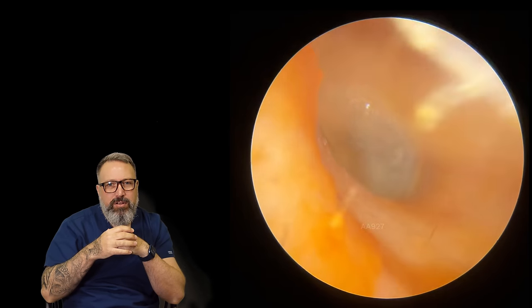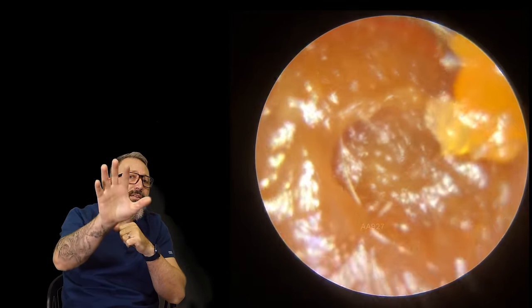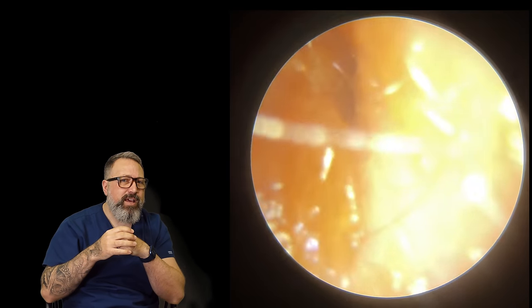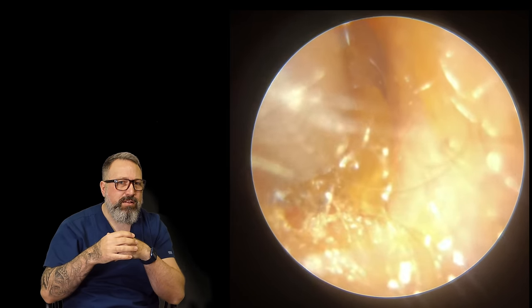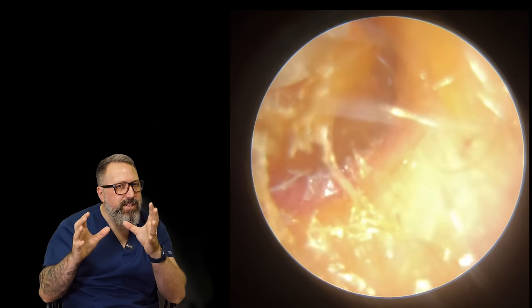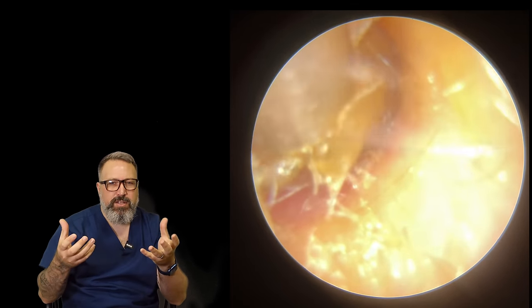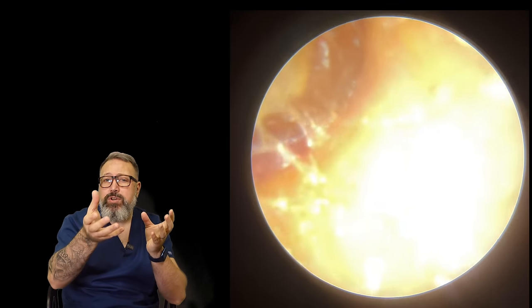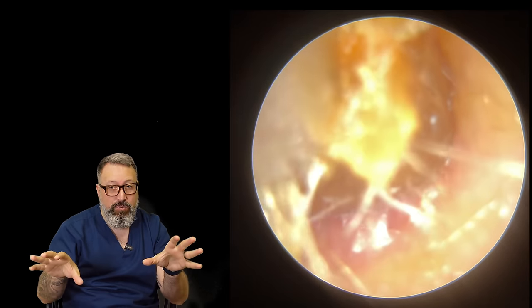So what's the other ear canal going to look like? Not quite as blocked - you can see the tympanic membrane beyond, you can really see down that ear canal. But this is right at the outside edge, in the cartilaginous portion of the ear canal - the very outer section. Oh, a little bit of a different consistency here though. There's that little bit of resistance to the wax as you lift it from the canal wall. I think we talked about this dryness to the canal wall, and that's what's happened here - it almost looks very, very dry.